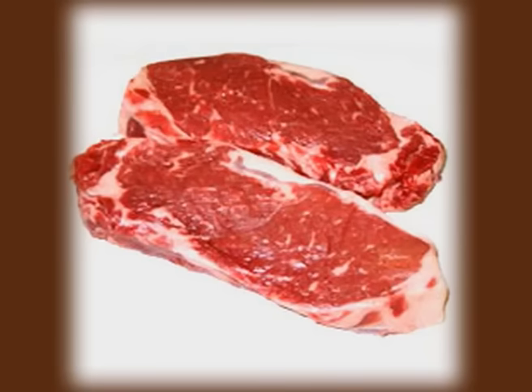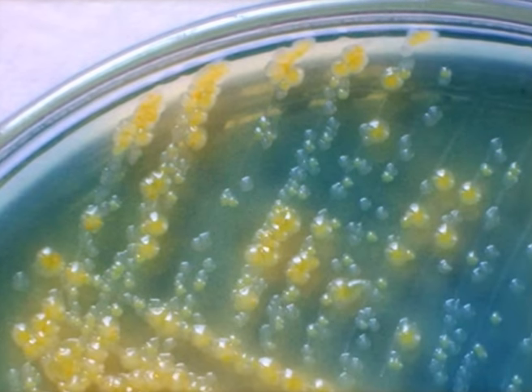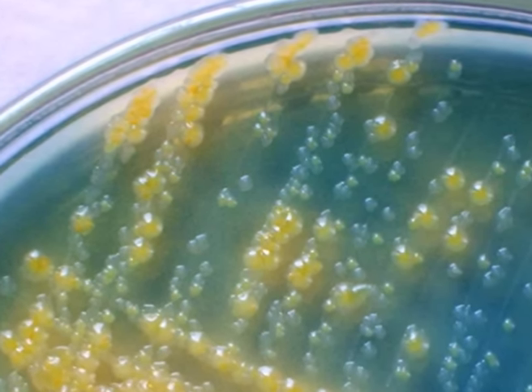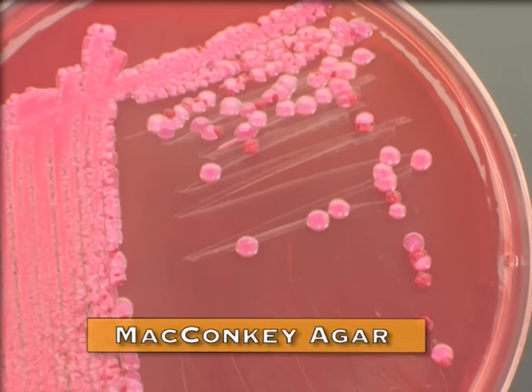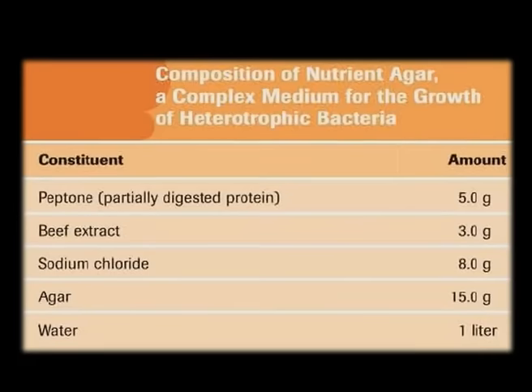Similarly, we have beef extract. Beef extract, derived from an animal source, is a rich source of organic carbon and energy, because we know that organic carbon is oxidized to obtain energy through the process of respiration. Examples of complex medium are tryptic soy broth and MacConkey agar. Why? Because all these kinds of medium contain ingredients like tryptone, peptone, etc., which are again derivatives of plant and animal sources, and we do not know the exact components of beef extract.